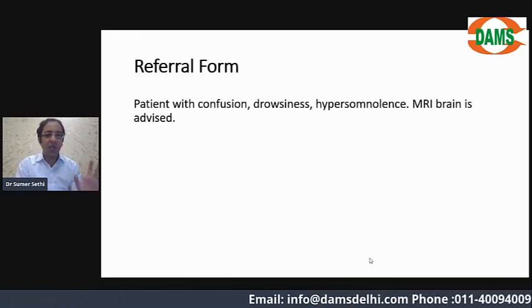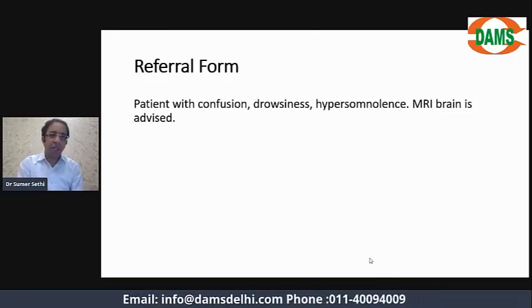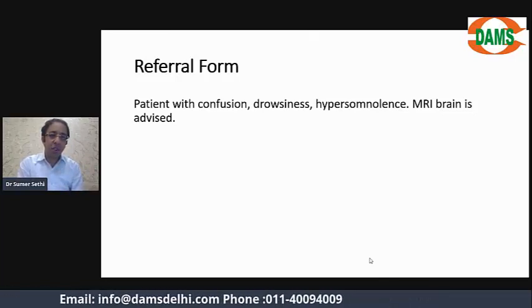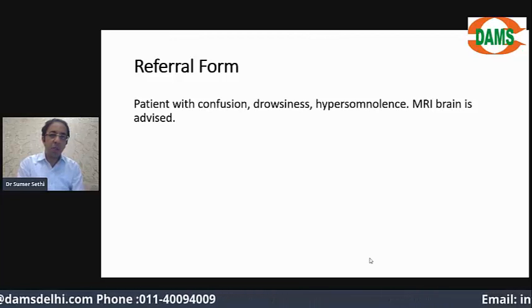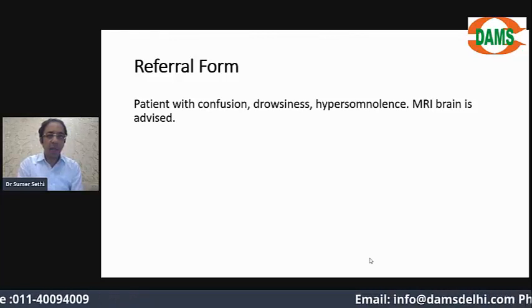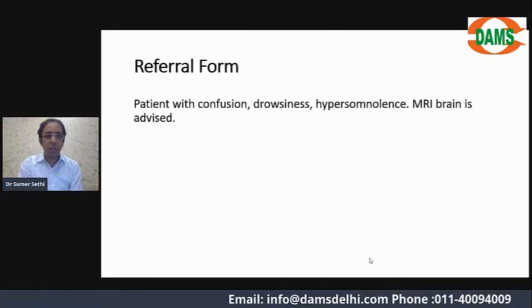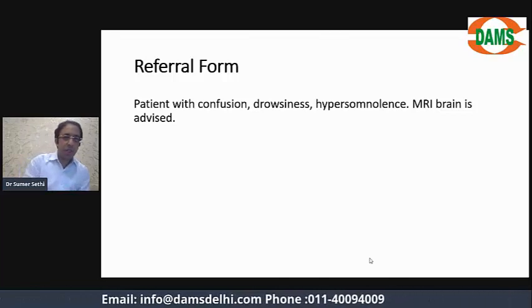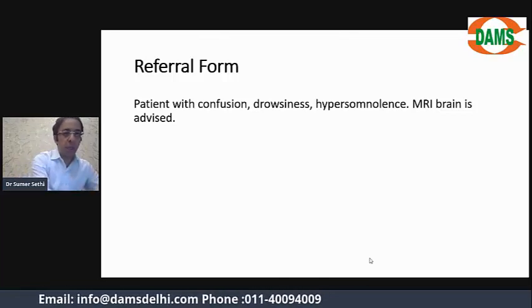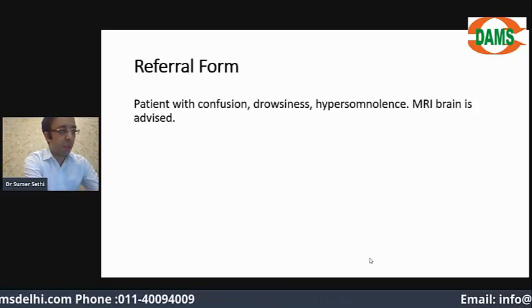Here is the referral form where only three words are written: patient with confusion, drowsiness, and hypersomnia — and an MRI brain is advised. We have to look at the MRI brain as radiologists.